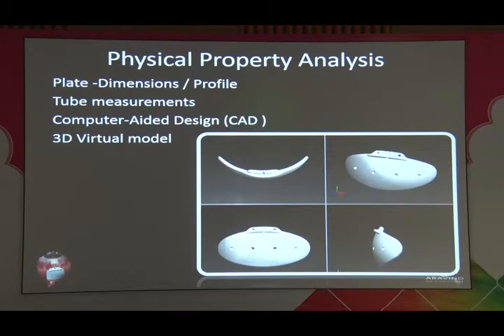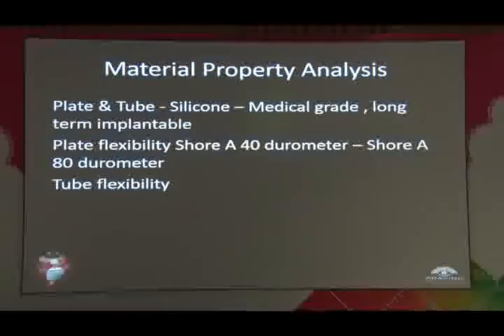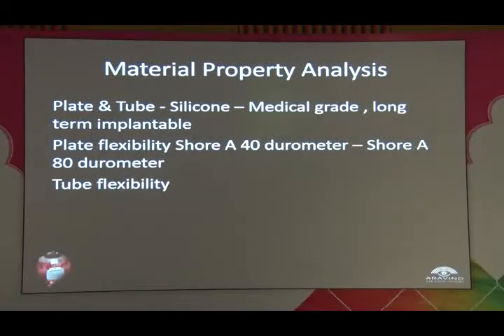The physical property analysis was carefully done, including the plate dimensions, the profile and the measurements, and a computed 3D virtual model was made. And, of course, the other material property, mainly the silicone: we selected from so many grades of silicone, but this is the best one, except for the barium impregnated.